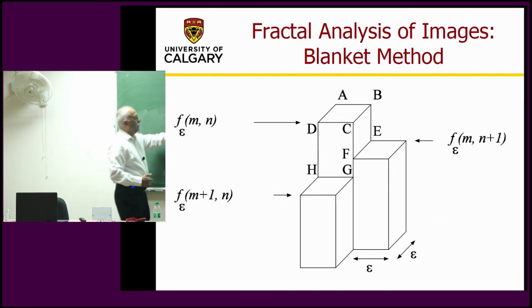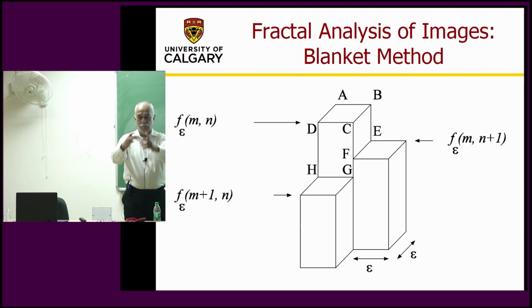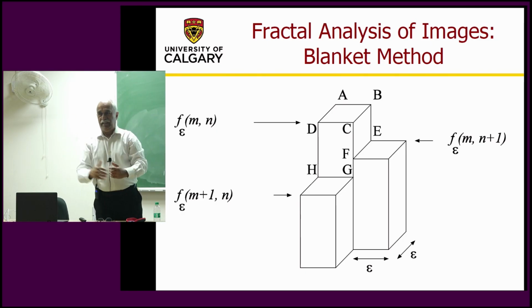So these are pixel values. On the top of the pixel, there is a certain area, depending upon your sampling resolution or pixel size. You have to cover that, cover this, but also these exposed areas in between. If you imagine these to be blocks, like building towers in the city center.